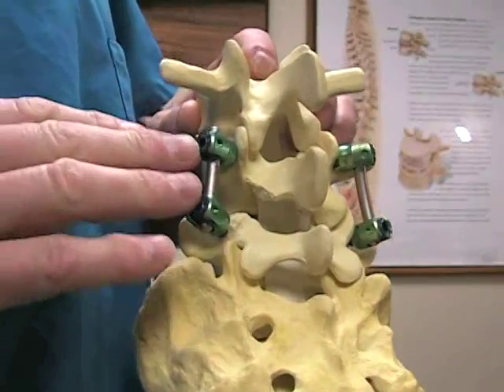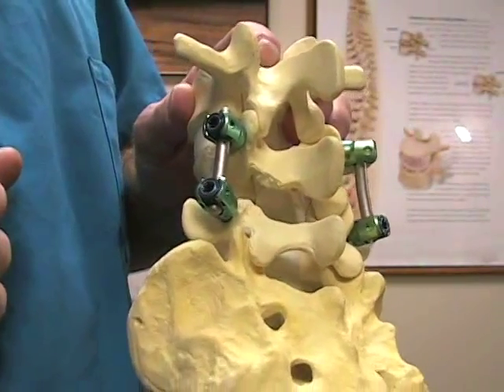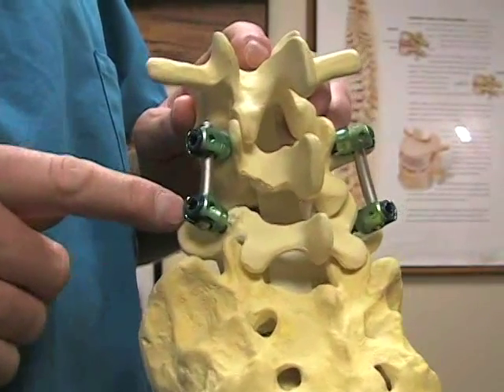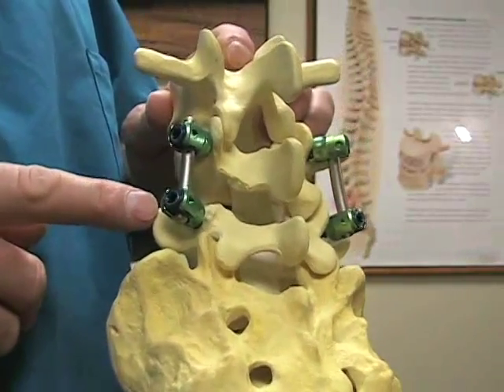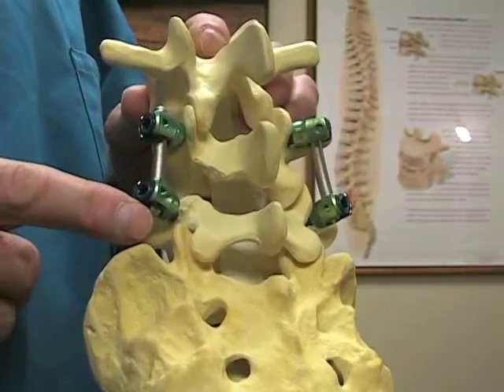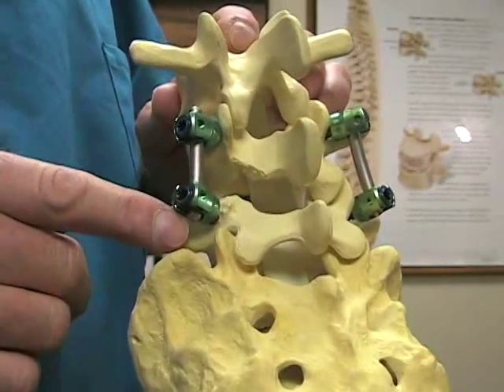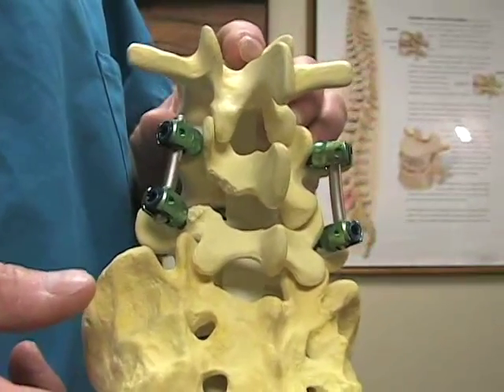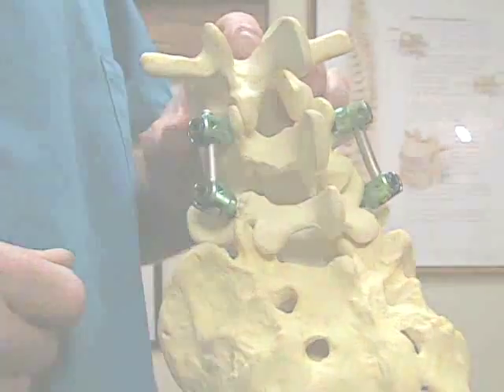Now, these screws are usually left in position. They don't cause any reaction with the body. It's all made of titanium, and you can have MRI scans through the titanium metal afterwards. It may produce some metal artifact, but patients can still be scanned with these in. But usually they're left in position. There's a lot of muscle over top of these, and so you don't feel the screws. However, if for whatever reason there was a need to, they can be removed. But again, ordinarily, if it's just spanning one level, the screws are left in position.